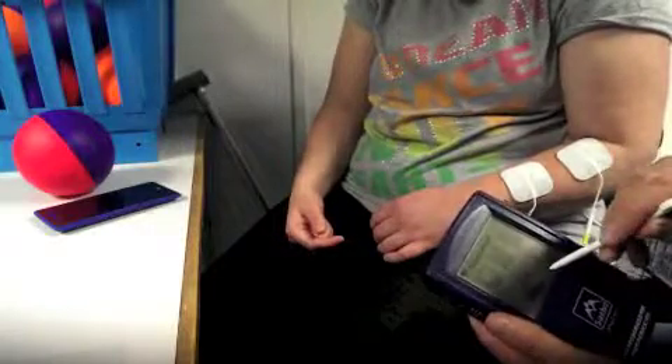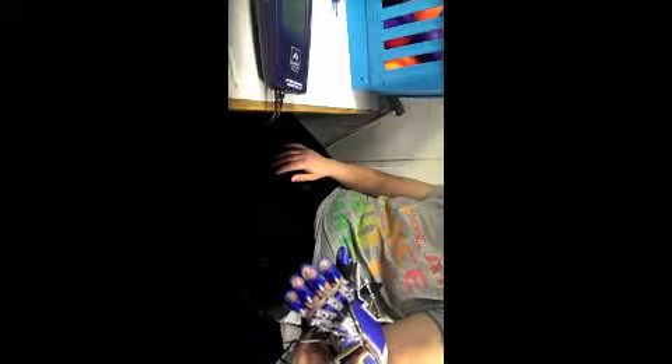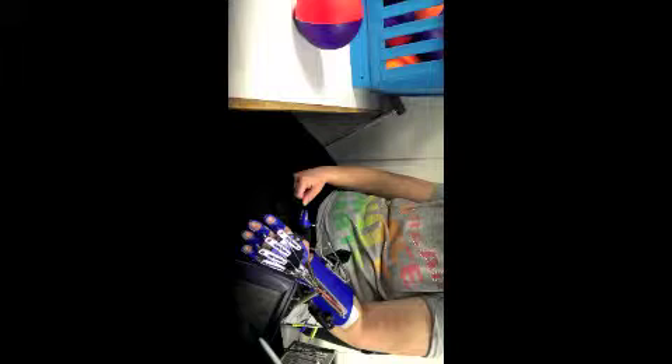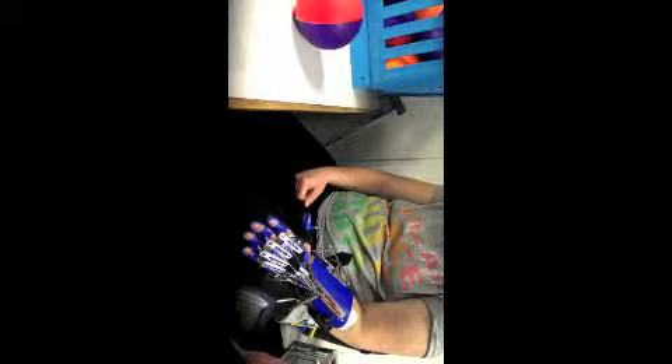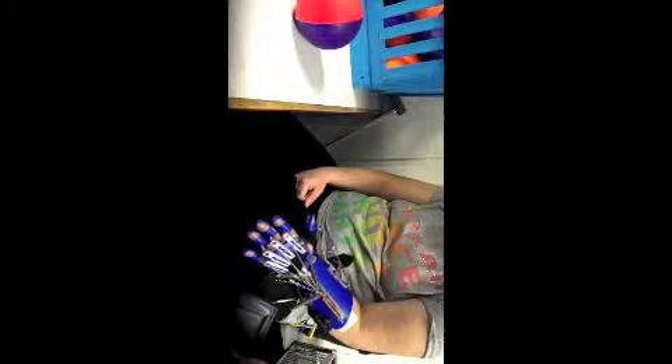We're happy with the positioning, so now we'll put the Saberflex on and go into a reciprocal EMG program. I'm just going to show you grasp and release without the e-stim. Give me a squeeze — good — and then let go. So we're on a slow spring. Now I'm showing you what the e-stim does with the Saberflex on — you can see the fingers moving a little bit inside, the little finger moving a bit more. That's 23 milliamps.